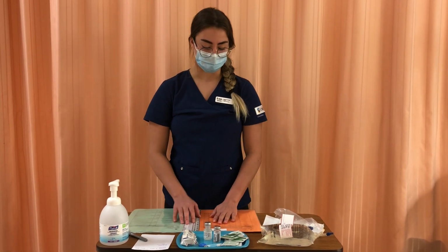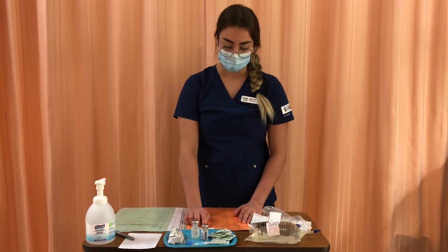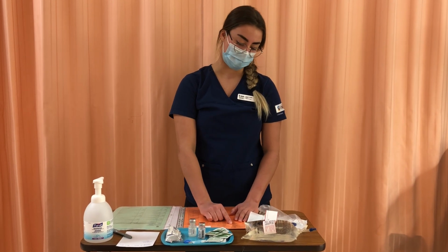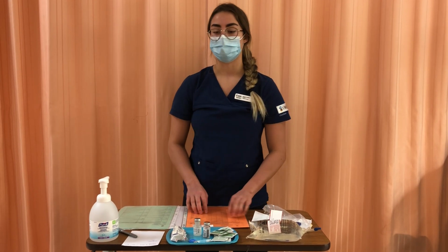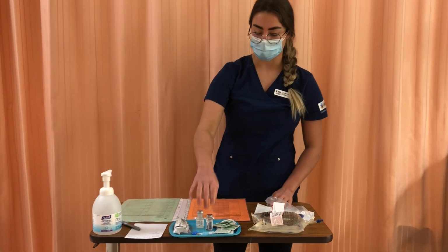So I'm going to go over my patient information. We have Benicio Vines. MRN is 099-1211, and I see their birth date here, and they have no known allergies. So I'm ready to pull my medication, so I'll do hand hygiene, and then I'll pull my medication.